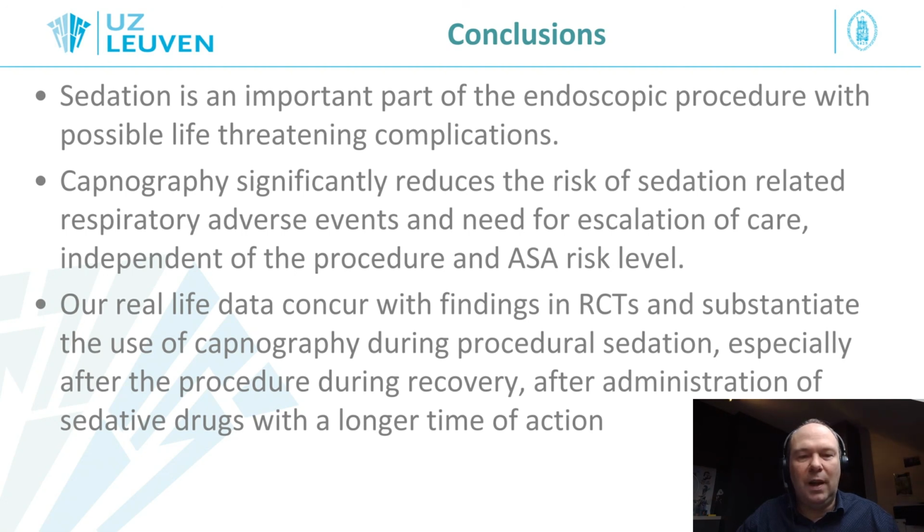So I think our real-life data here concur with findings of randomized controlled trials and substantiate the use of capnography during procedural sedation, especially after the procedure during recovery. I think this is really related to the use of sedative drugs with a longer time of action, such as midazolam and pethidine.